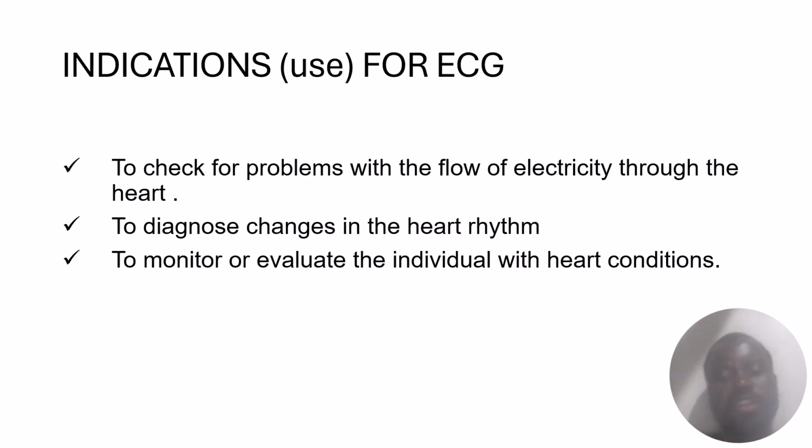So what would be the use of the ECG? It is useful to check for problems with the flow of electricity through the heart. It is also important for diagnosis of changes in the heart rhythm. It is also very useful to monitor or evaluate individuals with heart conditions.